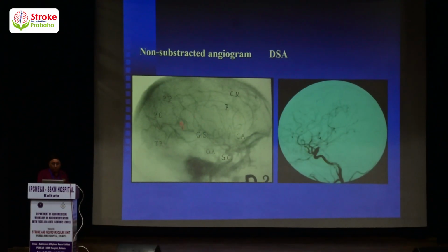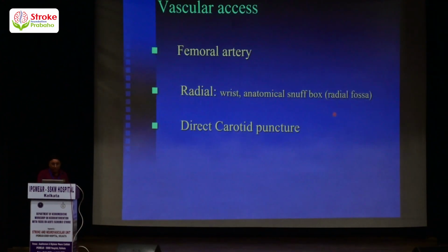So we have developed from here. You can see the difference between this non-subtracted angiogram and the subtracted angiogram. Here we cannot see the vessels very clearly. Now, with digital subtraction of the bony landmarks, the vessels are very clearly visualized.